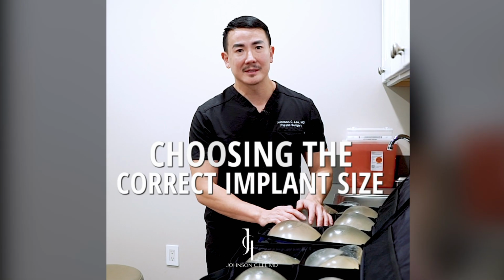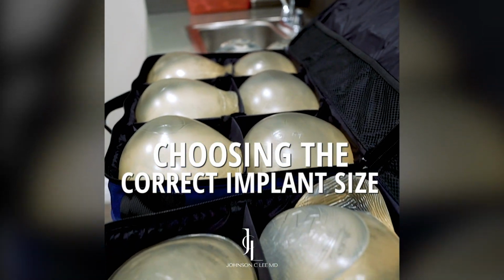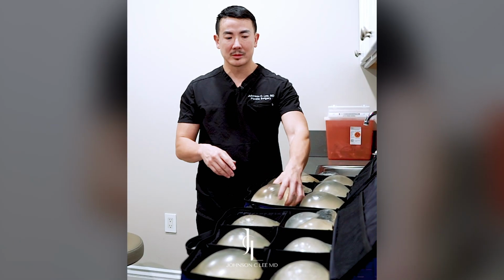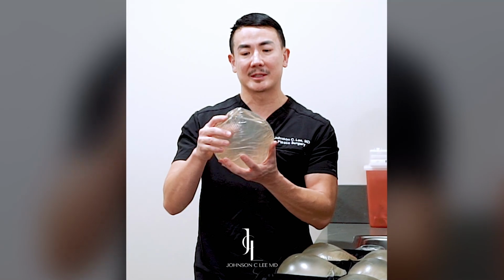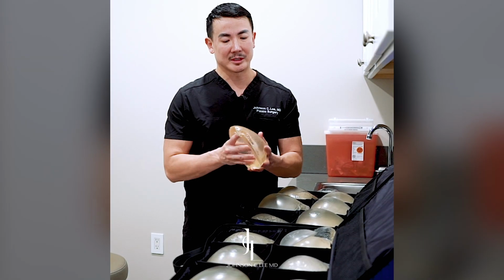So when picking sizes together with my patient, I have a sizing kit that I use, and there's multiple sizes in here. What the patient does is wear a bra, try on these molds, which pretty much simulate what a breast implant is going to look like in the breast. Then they can wear their favorite shirt, bring in their favorite dress, and try it on and see which size they like best.